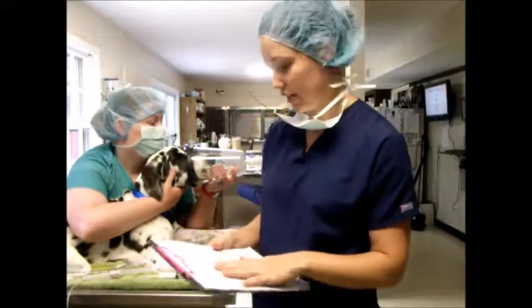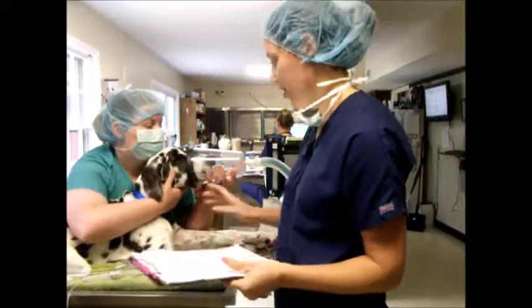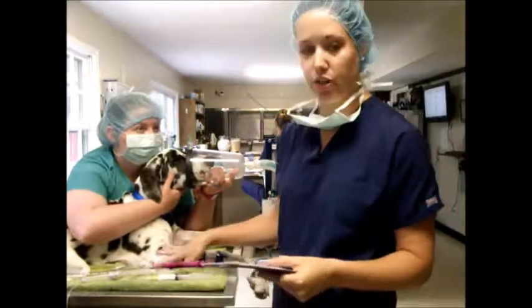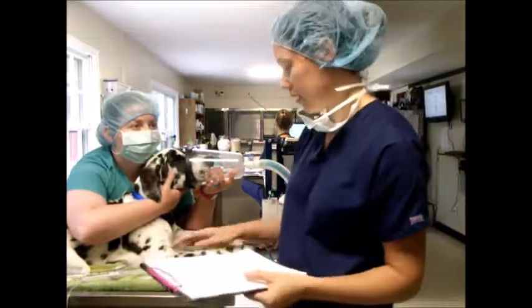I'm doing task 4, which is inducing. So I've got our patient here. She's been on oxygen for about six minutes now. We always want to make sure we pre-oxygenate for about five to seven minutes.